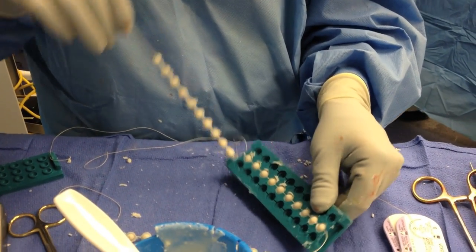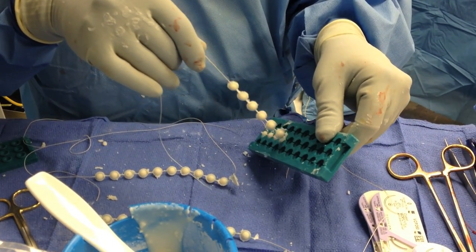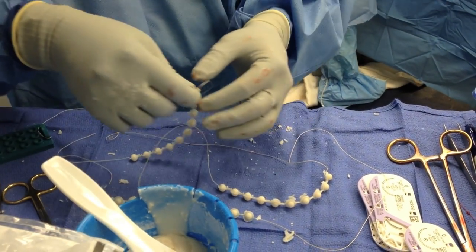These beads can be made by any surgical assistant or other surgeon available. The sutures on the end can be trimmed if desired. Often one end is left long to facilitate removal at a later date.